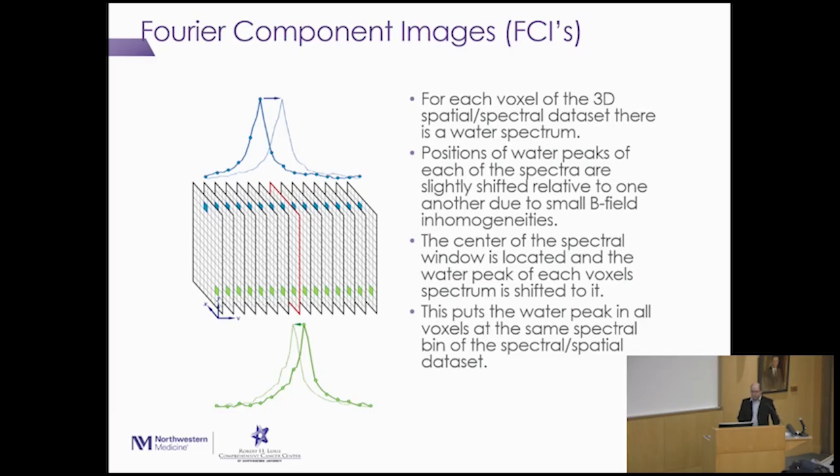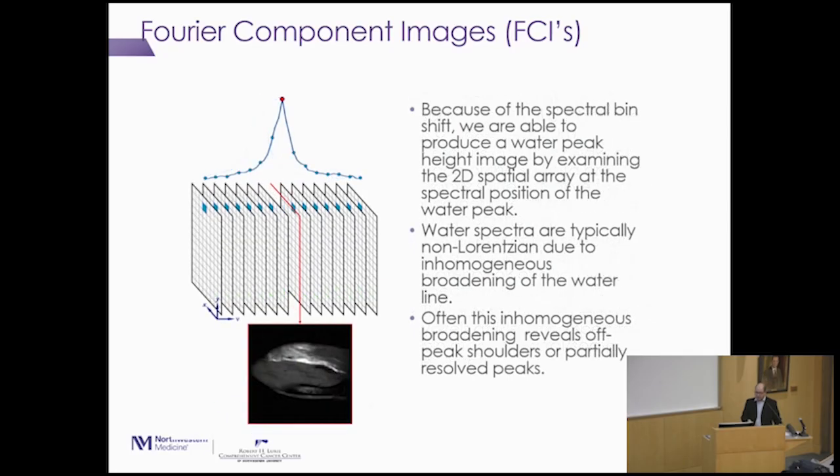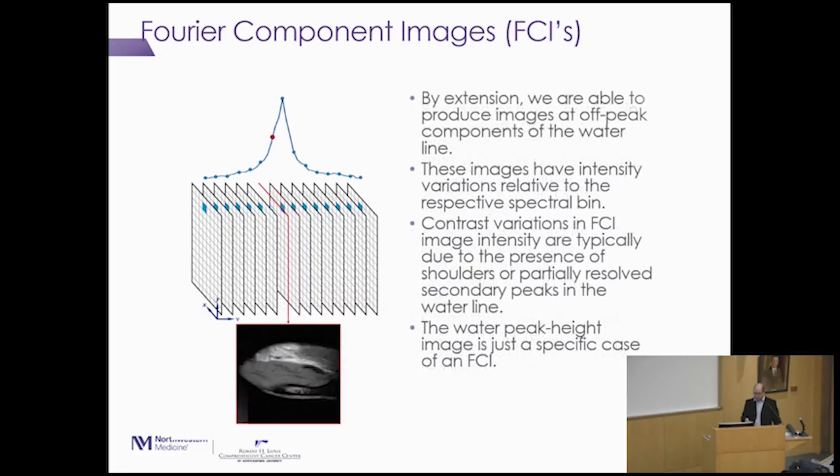And what we can do is look at the shift from the center frequency, and that gives you information on the shift in the water peak. That's one example I'll show. It's known that the tumor environment is different than muscle, and so you get these shifts in the spectra, and you can turn those shifts into a separate image itself.